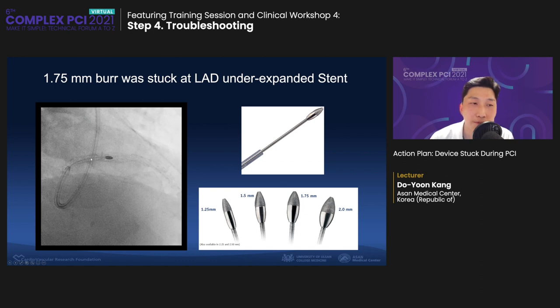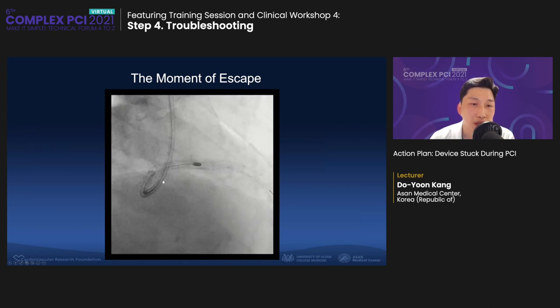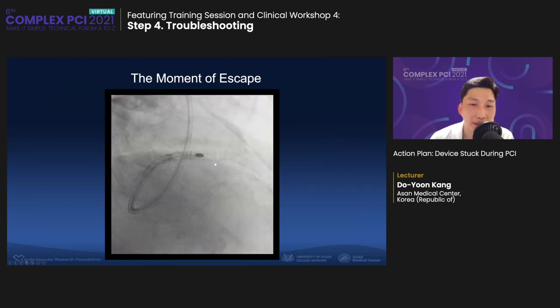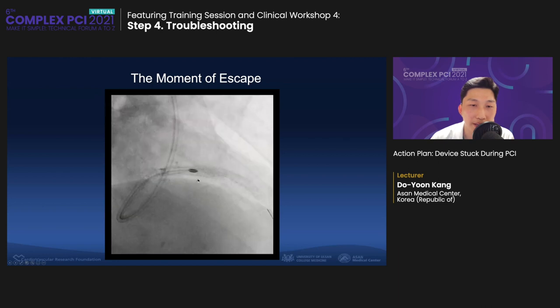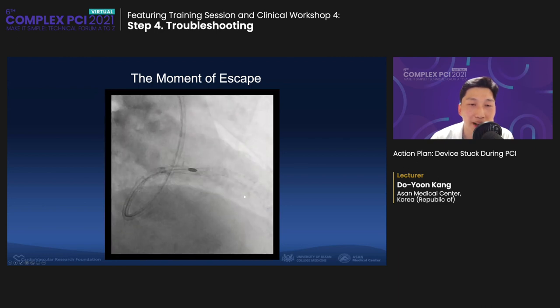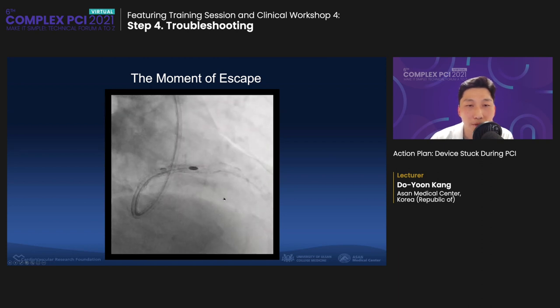As you can see, there is a diamond burr at the front side but not at the back side, and it was trapped. If we pull gently and slowly, there is some weak portion that stretches. So I pushed it in the guide catheter as much as possible, then pulled the wire and pushed at one time with very strong force — you can see the moment of escape.